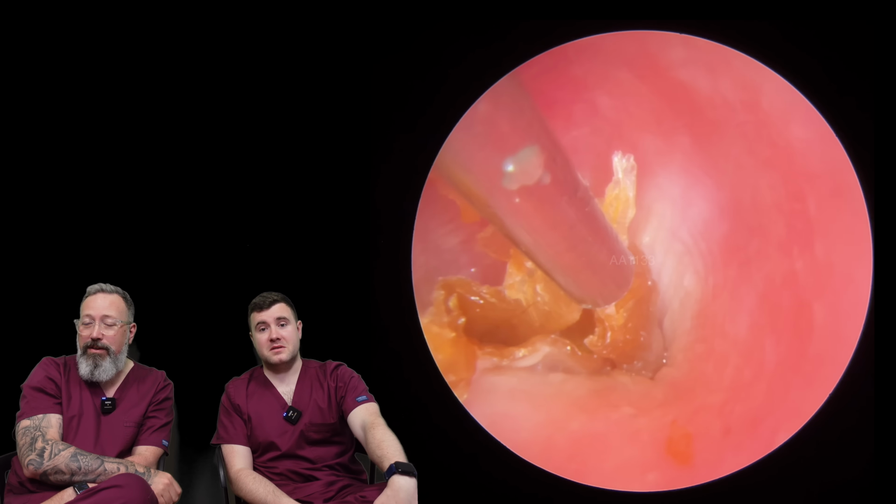Lots and lots and lots of oil gone in here now. I just want to lift this section to work some of the oil down behind that thicker skin debris. You'll get an idea of just how deep the recess is now when this comes out. You'll see the size of it. You can see how that was lifted. It was lifting up, but it just wasn't quite enough power. And this piece at the top is quite frustrating, because it naturally always lifts back up to that original position.